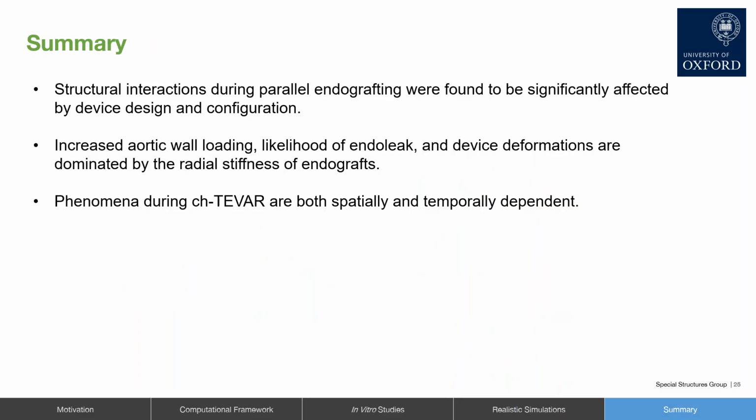Okay, now, in summary, what we've seen here is that structural interactions during parallel endografting are significantly affected by both device design and configuration. We see things like increased aortic wall loading, likelihood of endoleak, and increased device deformations are dominated by the intrinsic properties of the endografts. Perhaps most interestingly, and perhaps most relevant to the clinical community, is that the phenomena that we're seeing during chimney TEVAR are both spatially and temporally dependent.